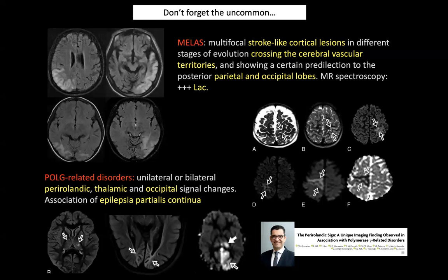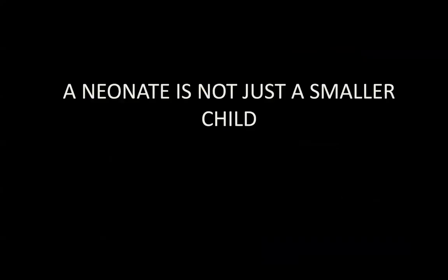And if you really want to know everything about what we know on seizure-related changes in the brain, check out the other talk on my YouTube channel done by Professor Tortora from Gaslini. That said, these are two important patterns that are included in the realm of the mitochondrial disorders you need to know, because you don't want to diagnose this as HIE or stroke. This is very, very important.